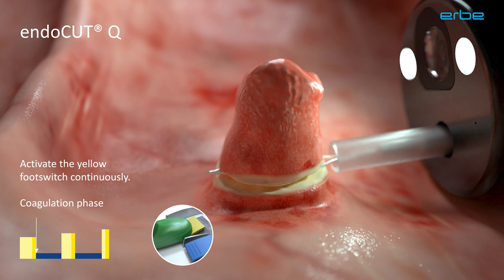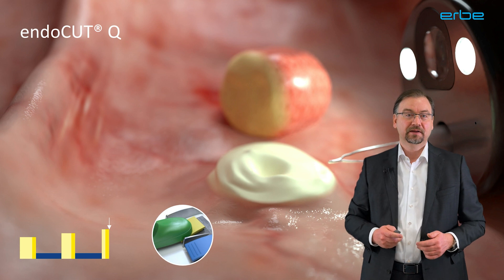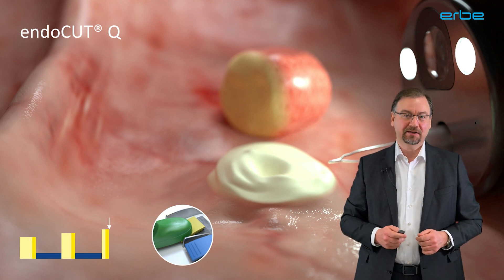Then the second cutting cycle begins. Again, first resulting in a coagulating tissue effect. Note that the first sparks form a little sooner now because the tissue is already more desiccated than in the beginning. Again, only when the sparks start to form, the cutting begins — indicated by a little beep. This process is repeated as long as you press the yellow footswitch. In this example, altogether it took just three cycles to resect the polyp. Could be fewer, could be more, very much depending on the individual situation.